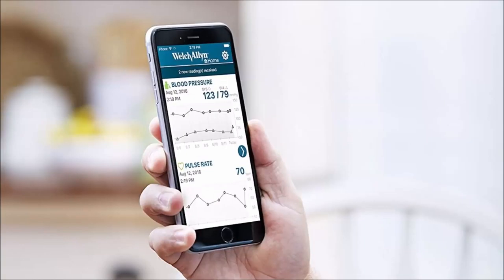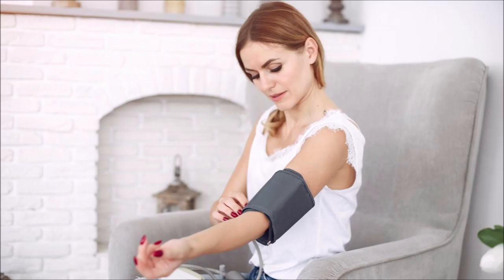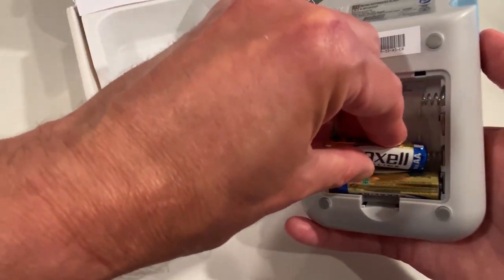The downside is past results can only be read in your app, and it's only made for one user, even though anyone can use it. And as I mentioned before, it doesn't come with a power cord, so you must use battery power if you don't purchase the wall plug.